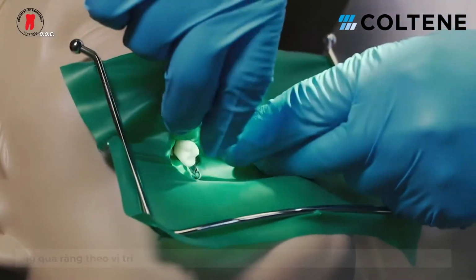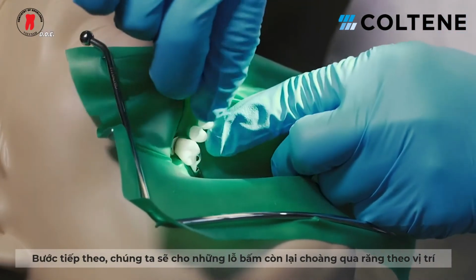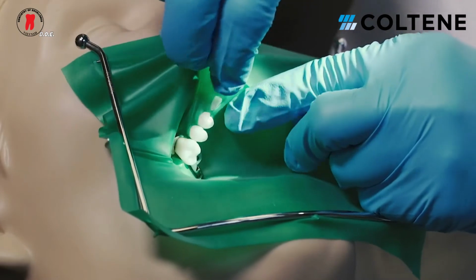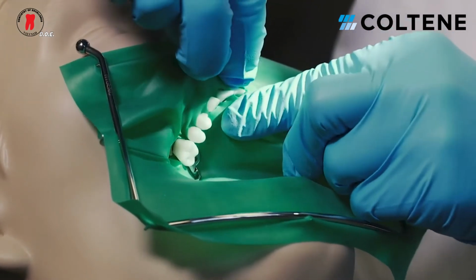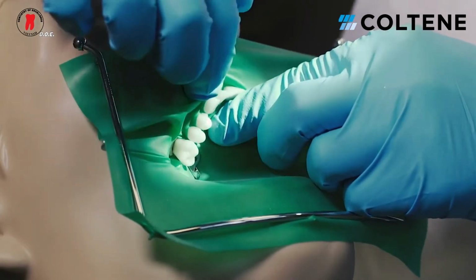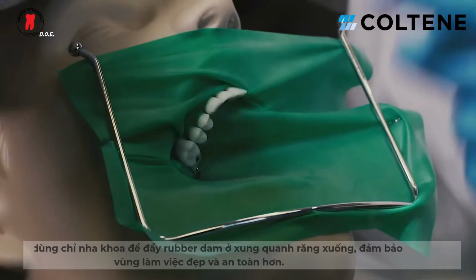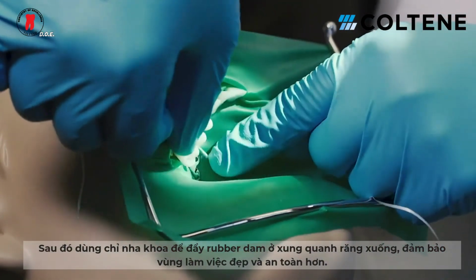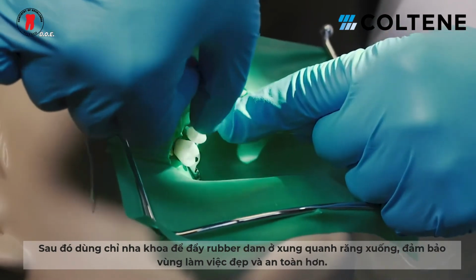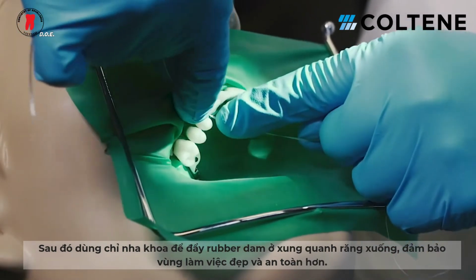Okay, so our next step is going to be now to open every perforation to every tooth that we're going to isolate. In this particular case, we're going to go all the way to the mesial aspect of the central incisor. Once the rubber dam and all the holes have been opened, we're going to use a floss and we're going to just push the rubber dam apically around each tooth so that it's nice and secure.